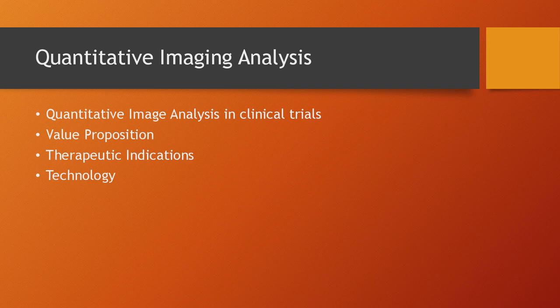We are working with multiple myeloma and lymphoma clinical studies, and we have been recently involved in a clinical trial in multiple myeloma, monitoring minimal residual disease. And for that, we have analyzed the PET-CT examinations post-treatment in order to evaluate residual disease that was not evident to the naked eye. And we have identified patients that have minimal residual disease using a quantitative image analysis of the PET-CT scan post-treatment.